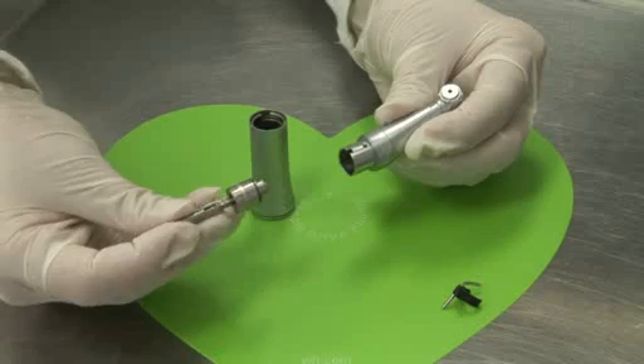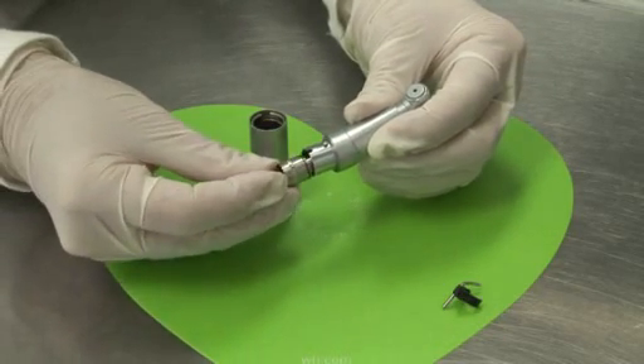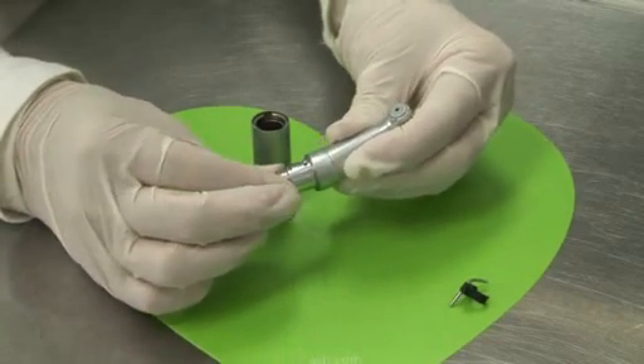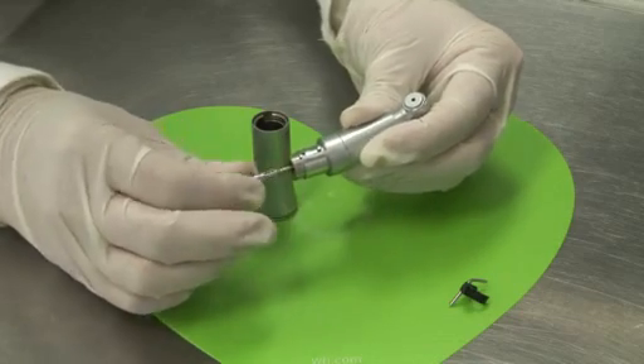Taking the rear gear assembly, matching up the rectangular pin to the notch, gently insert, twist, press to make sure that it just gently engages in and twist again.